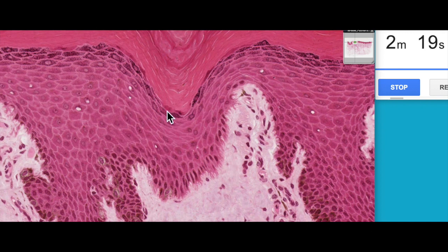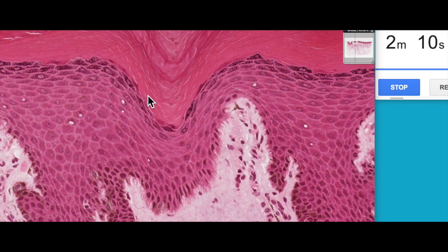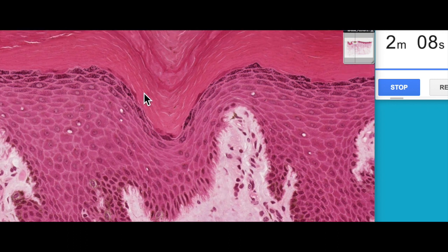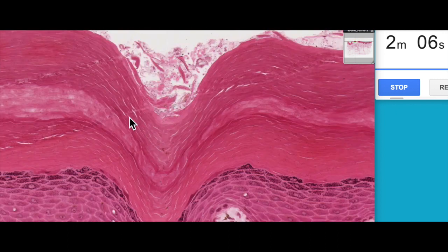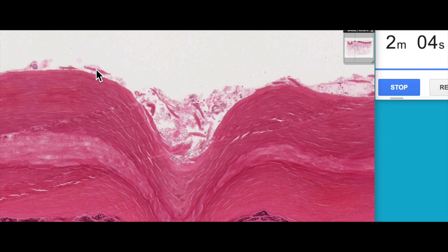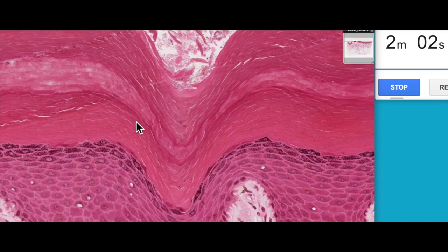The cells undergo cell death here — you can actually see that they lose their organelles. The nucleus degenerates and we end up with basically these membranes filled with keratin. This layer here is the stratum lucidum, which eventually becomes the stratum corneum, and then these cells are shed from the surface.